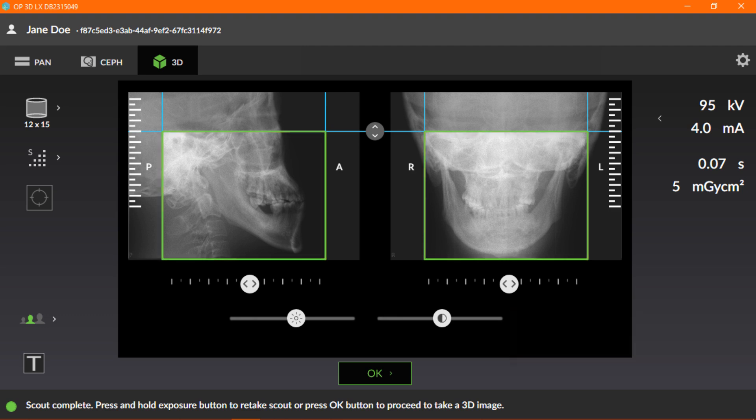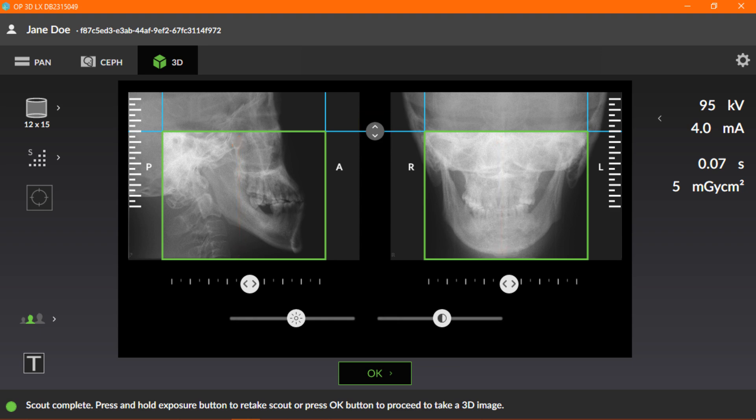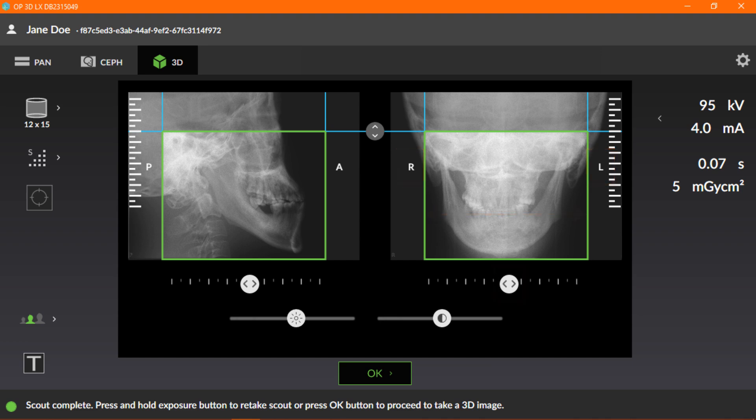Now, let's learn about fine-tuning the region of interest. Use the height adjustment icon to adjust the height of the field of view. Use the right slider icon to adjust the field of view position in the left and right direction. And use the left slider icon to adjust the field of view position in posterior, anterior direction.